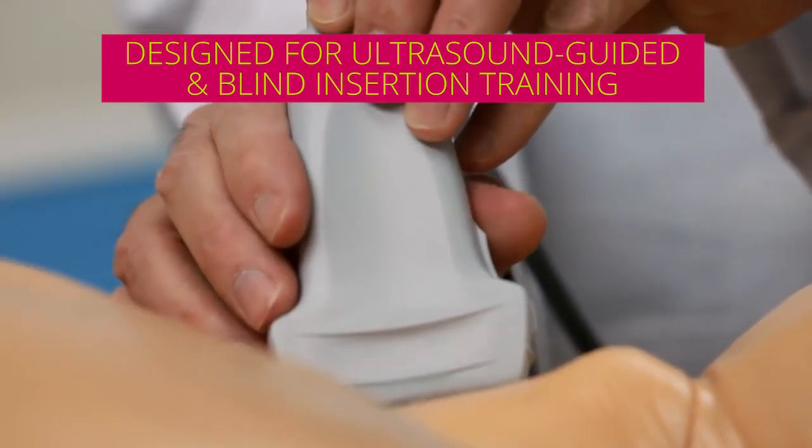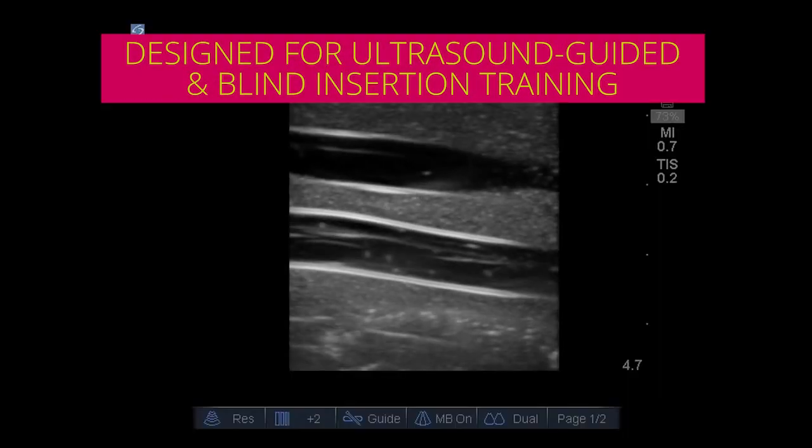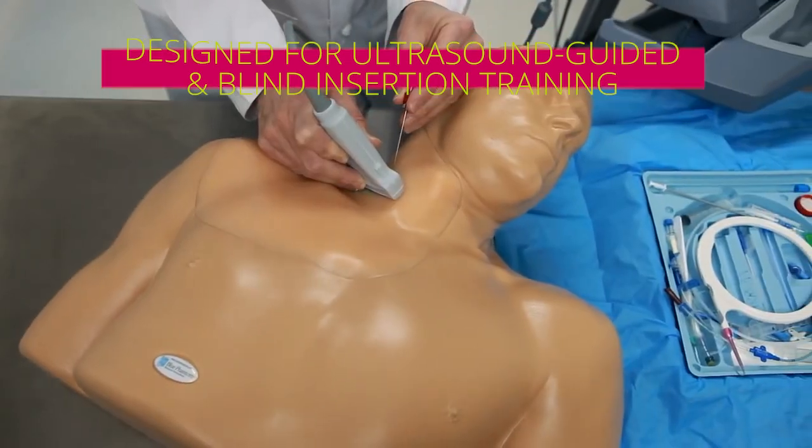Designed for both ultrasound-guided and blind insertion procedural training, this central line mannequin is perfect for your needs.